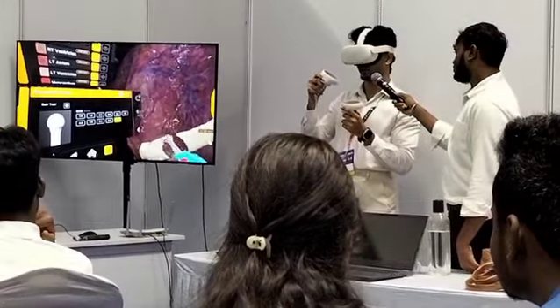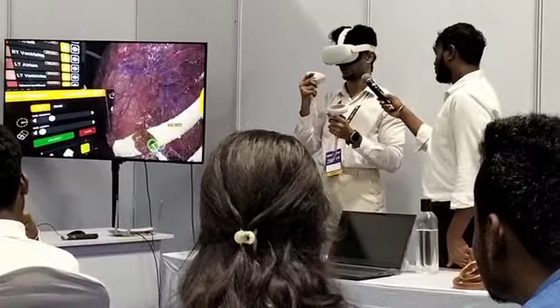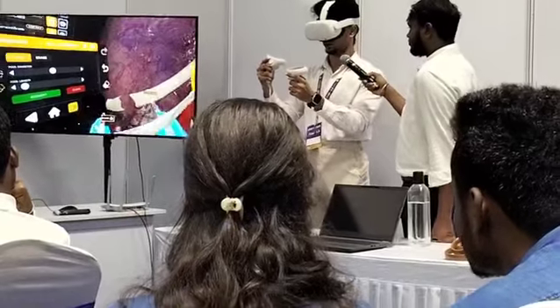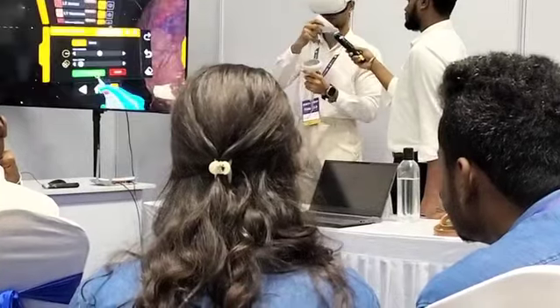I can either do this, or I can come back out. I can use this particular option. Take the region that I want to take off and click on save.